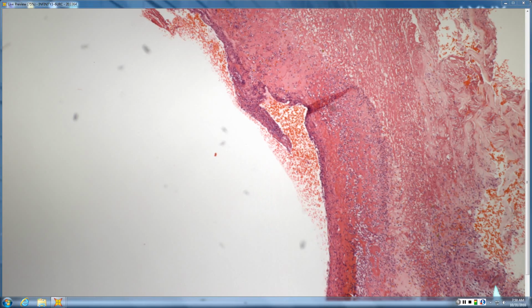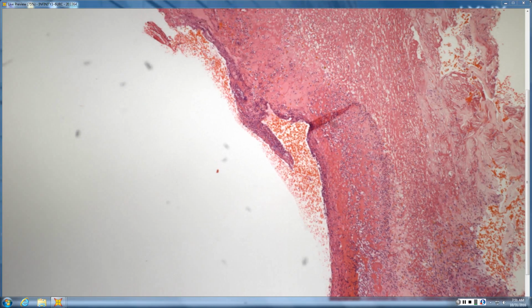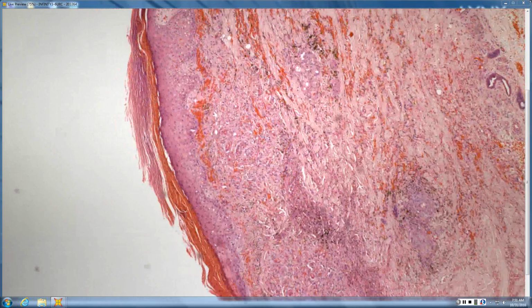Be careful, because you're always going to get a little vasculitis in any ulcer bed. Traumatic ulcer, decubitus ulcer, regardless of what the ulcer is, you're going to have a little bit of vasculitis in the ulcer bed. That just goes with having an ulcer. So now you go away from the ulcer to see what the cause might be.